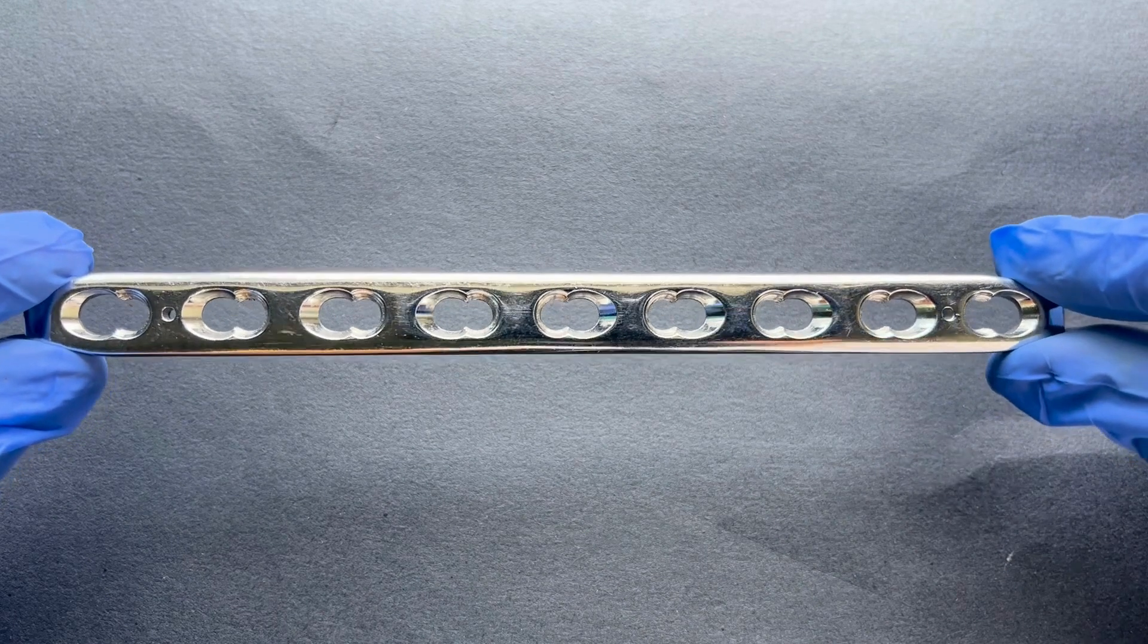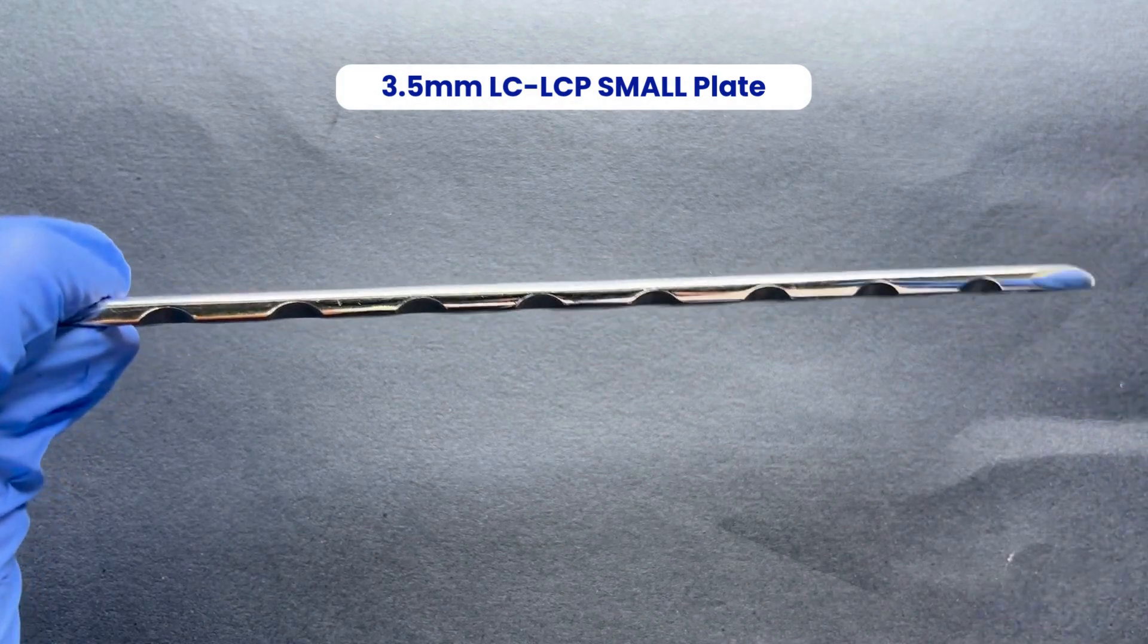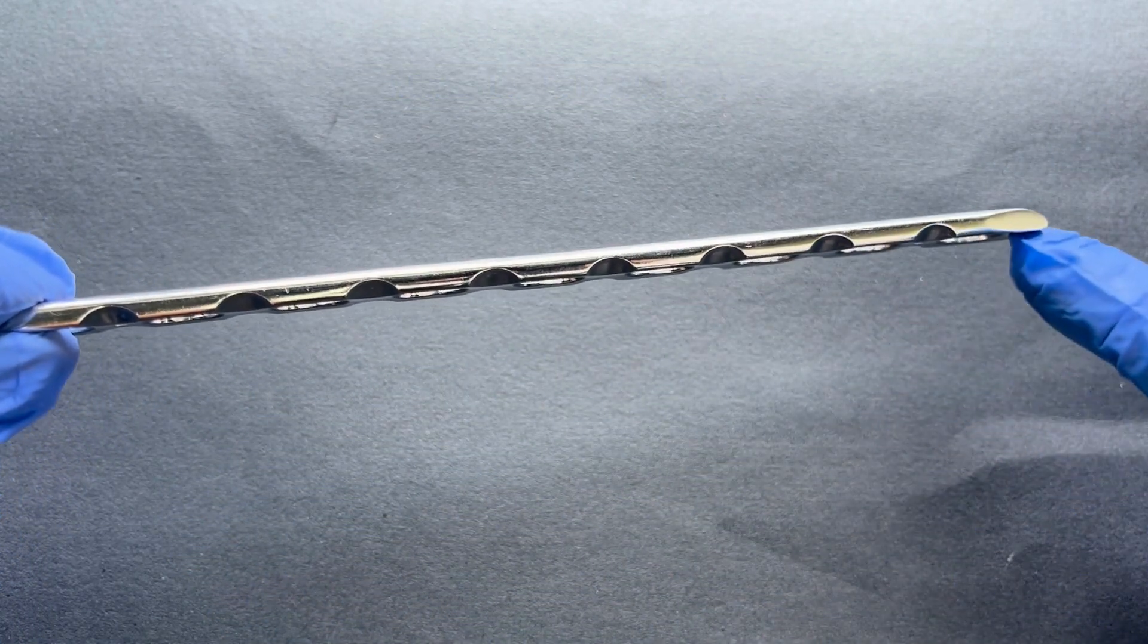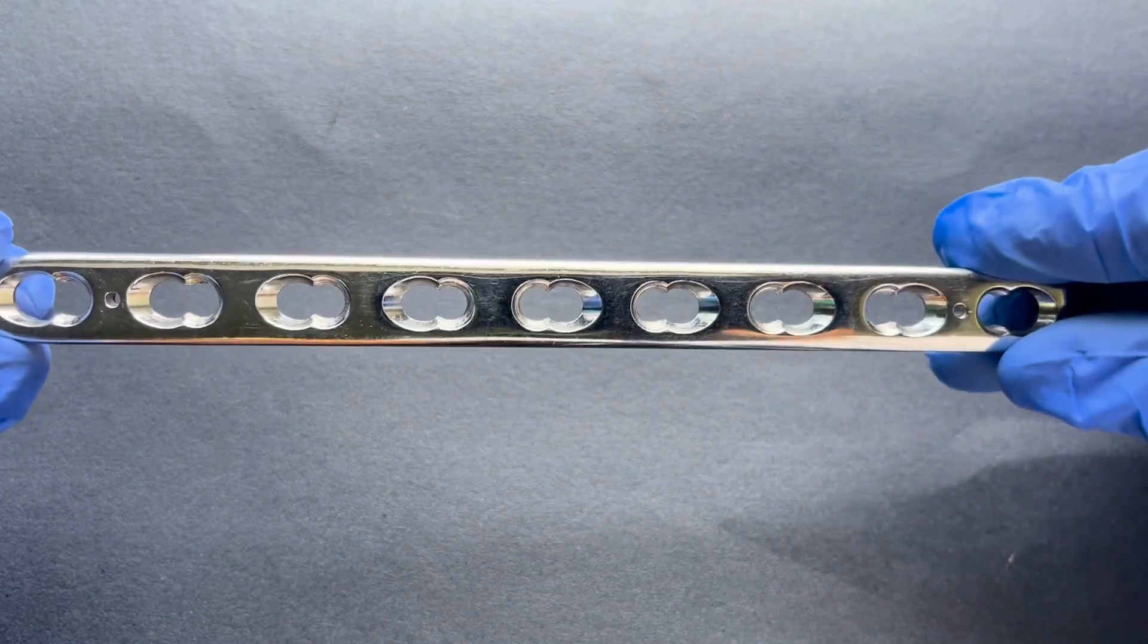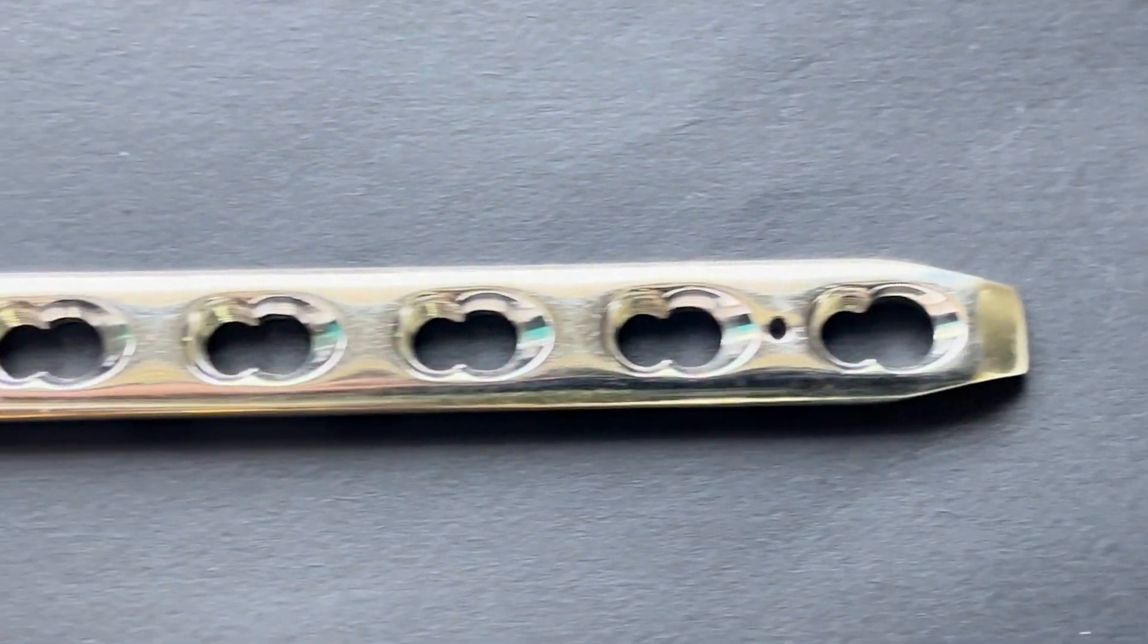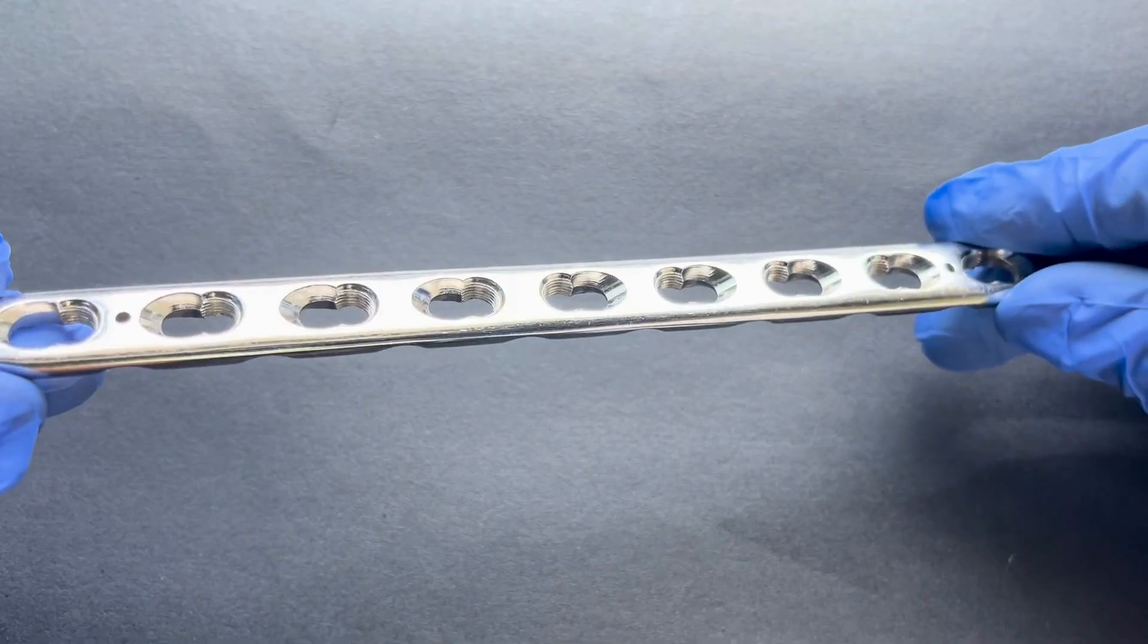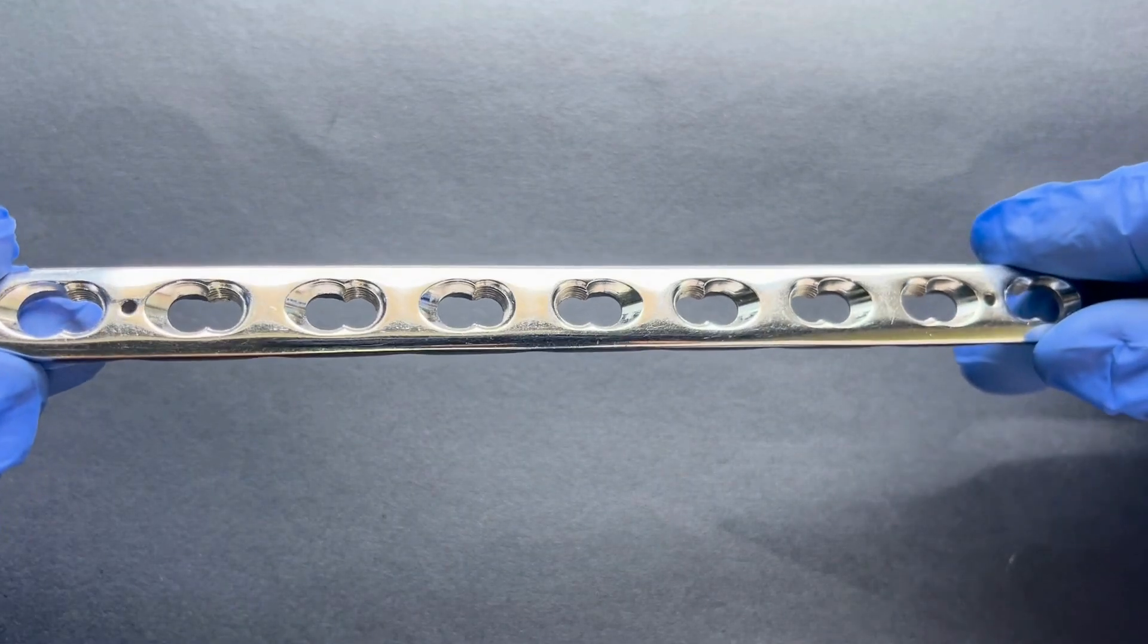Starting with the 3.5mm LCLCP small plate. It ensures precise, limited contact fixation in smaller anatomical regions. This locking compression plate minimizes periosteal damage while providing stable osteosynthesis.